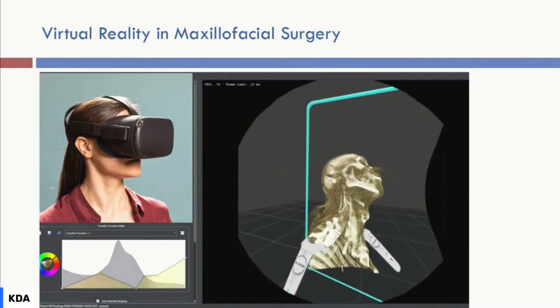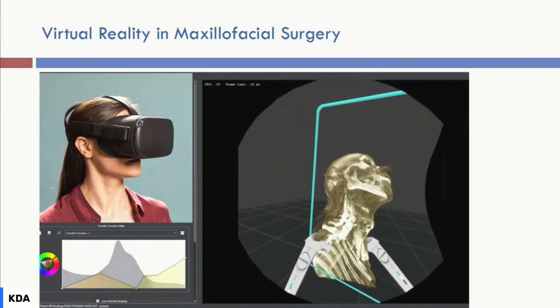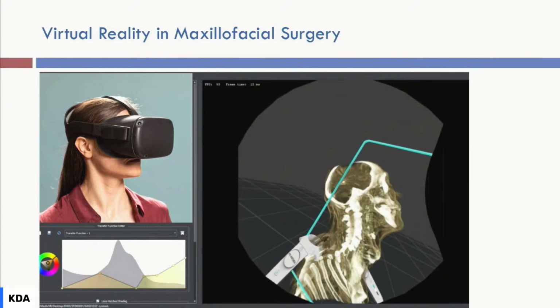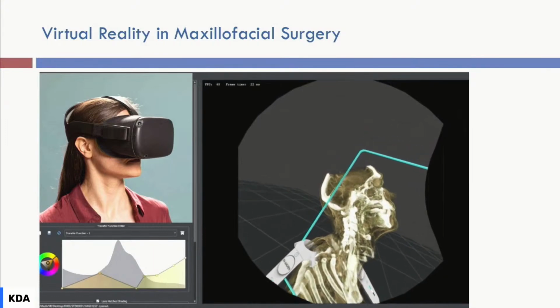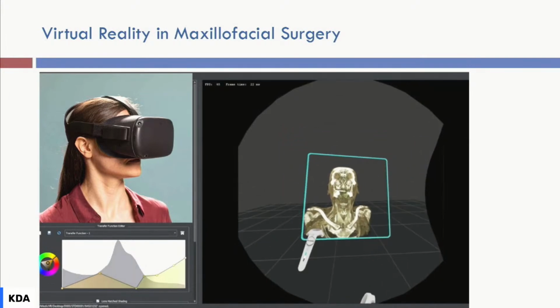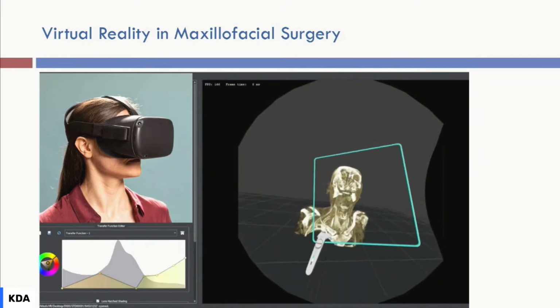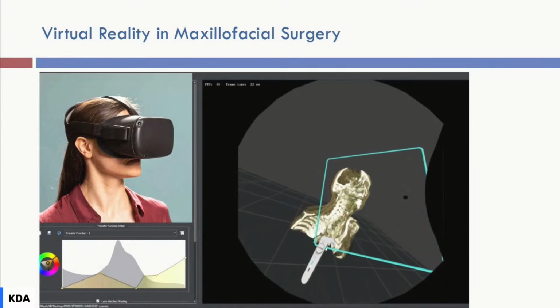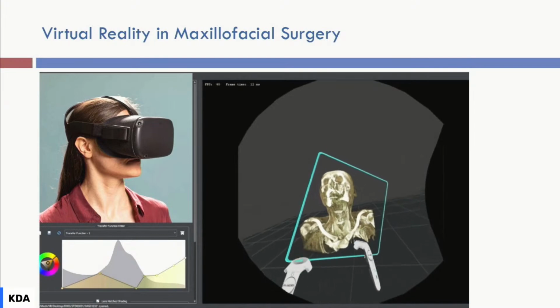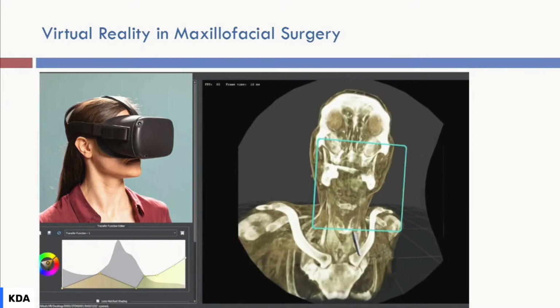So this is also work that I've been working on, trying to augment virtual reality and use it in the field of maxillofacial surgery. So we took the CBCT of patients, and we are able to use the VR cameras, so augmented reality cameras, and with the handles, you can dive into the CBCT and the CT of the face.